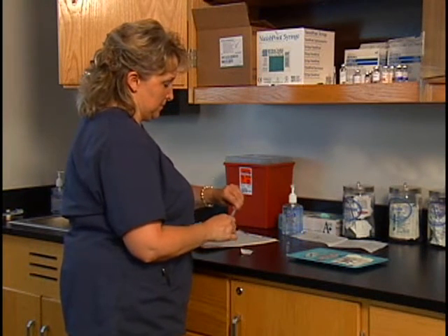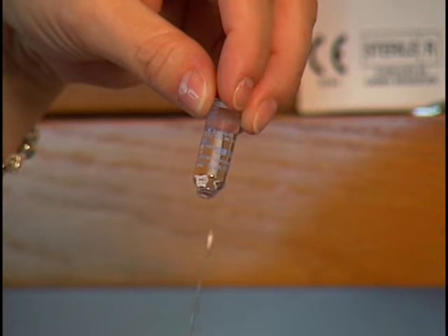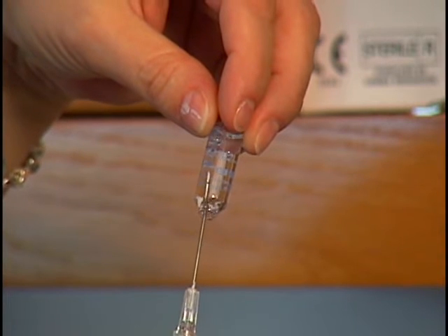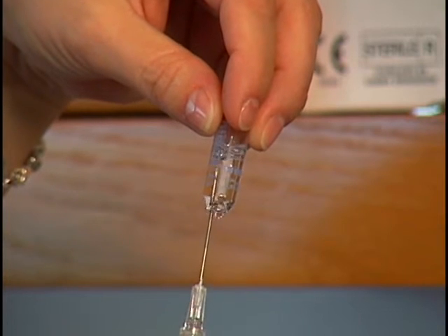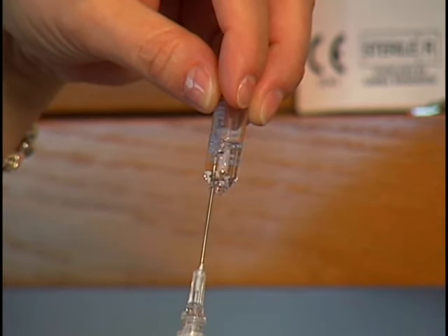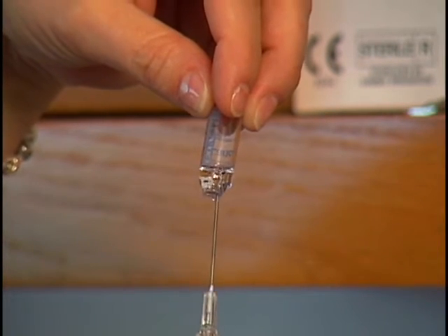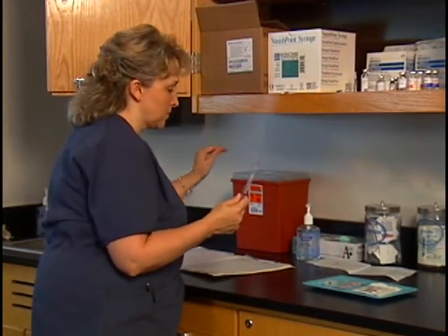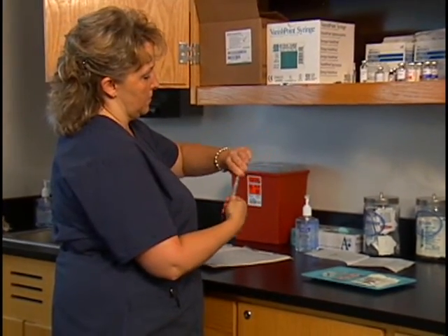Invert the ampule so that it is upside down. Insert the needle into the ampule, making sure to keep the needle opening below the fluid level. Withdraw the proper amount of medication by pulling back on the plunger. Move the needle downwards as necessary to keep the needle opening immersed in the fluid. After withdrawing the proper amount of medication into your syringe, remove the needle from the ampule and replace the needle guard. Dispose of the ampule in a biohazard sharps container.